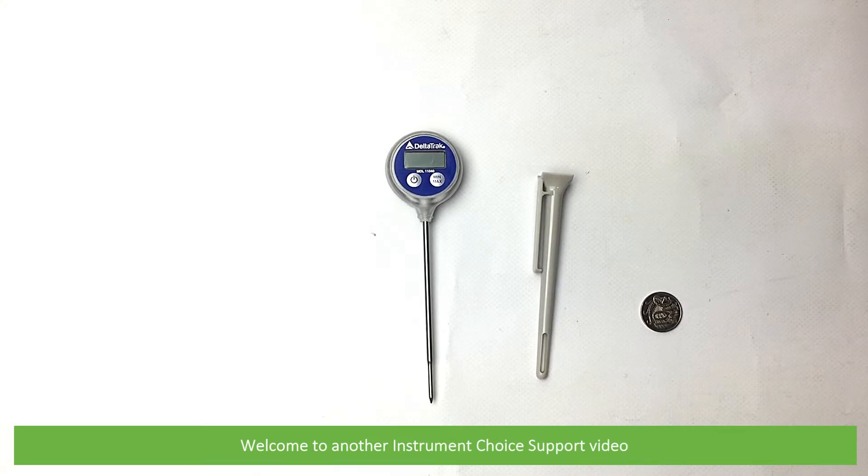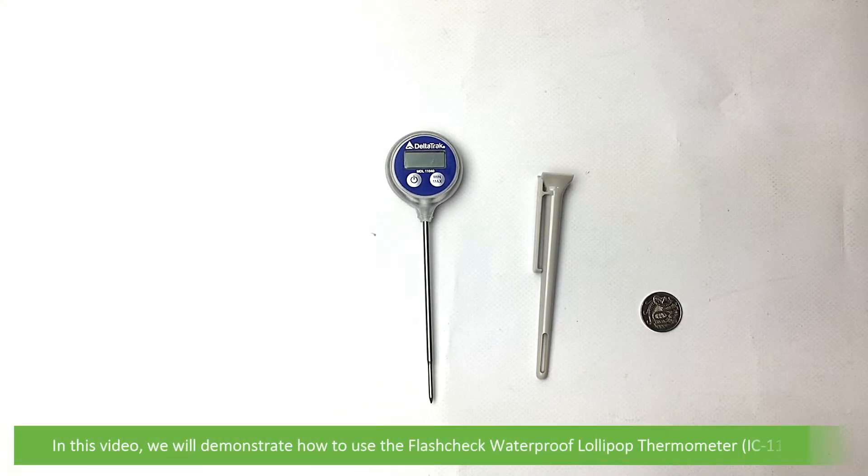Hi and welcome to another Instrument Choice support video. In this video we'll demonstrate how to use the flash check waterproof lollipop thermometer, the IC-11040.